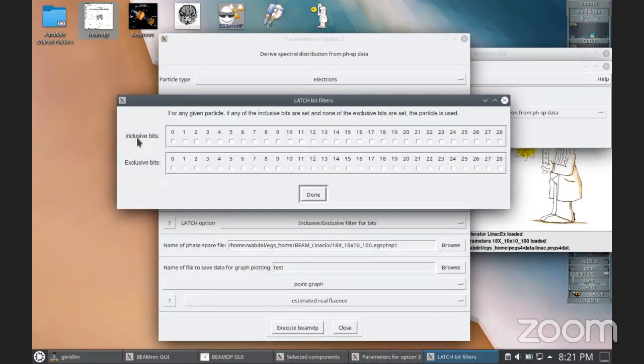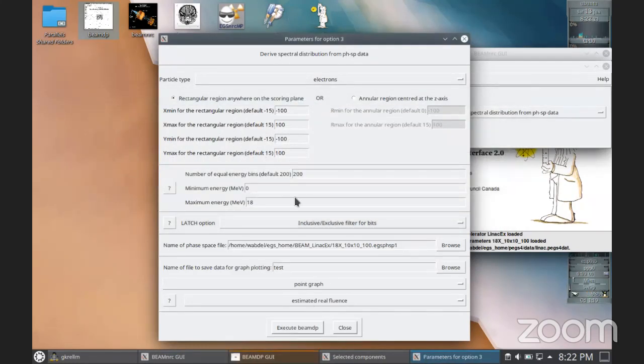So here includes, for example, I want everything to be, I think we had a latch 13. So for example, if I disable all of this off, I forgot which latches we used, either 13, 14, 15. The one with the electron was, I think, 11. For the jaws, remember, for the jaws. No, I think it was, okay, I'm gonna just put all three, doesn't matter. So now let's execute.